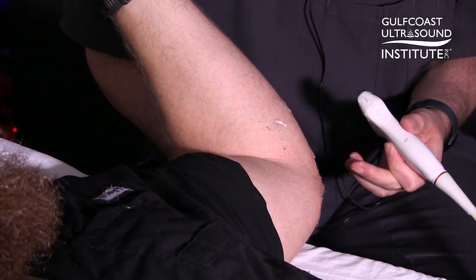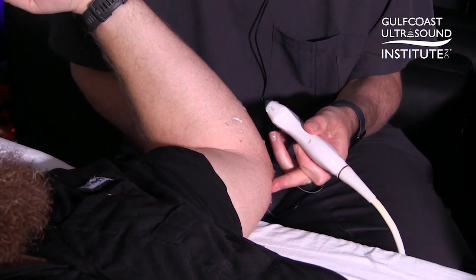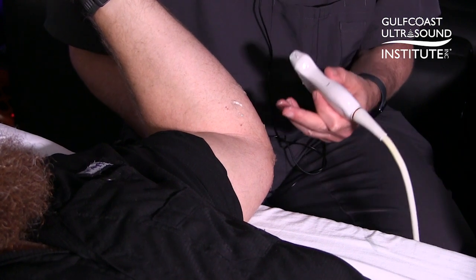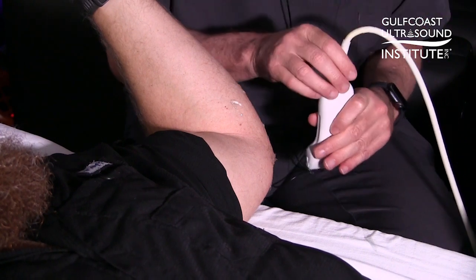The ulnar nerve is a very complex nerve at the elbow and can have a lot of dynamic influence. It can sublux over the medial epicondyle with movement. There can be other things like an effusion, or changes like compression from the medial triceps muscle.